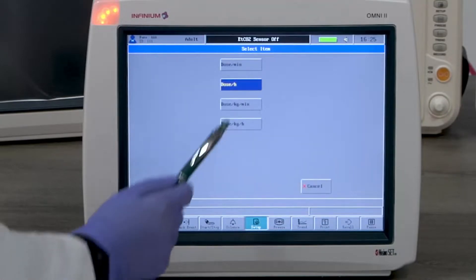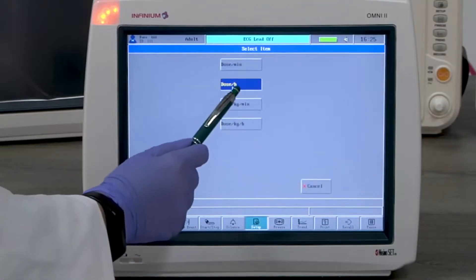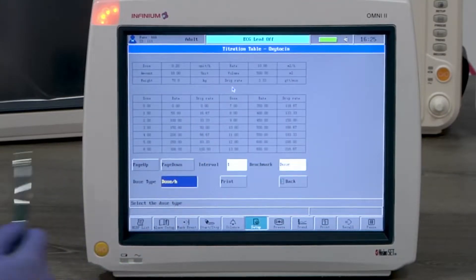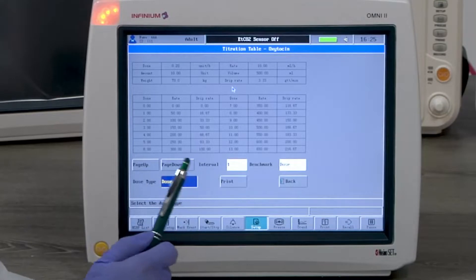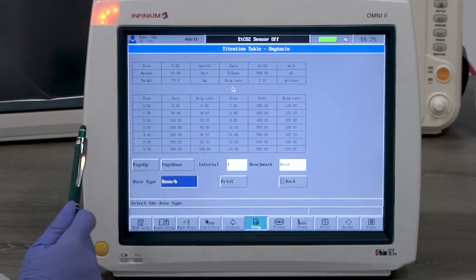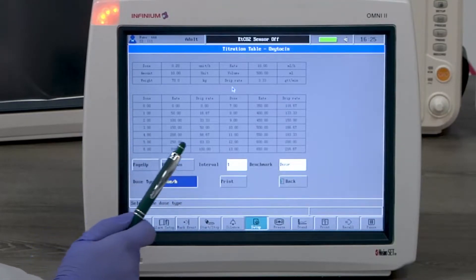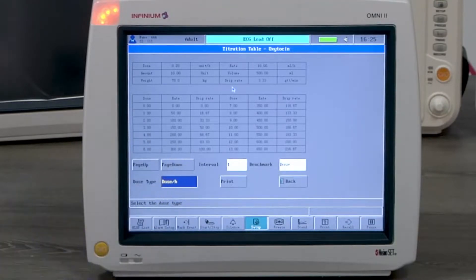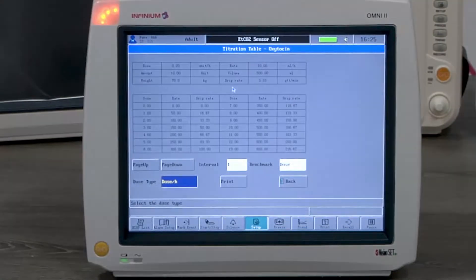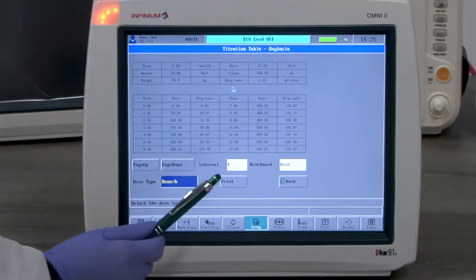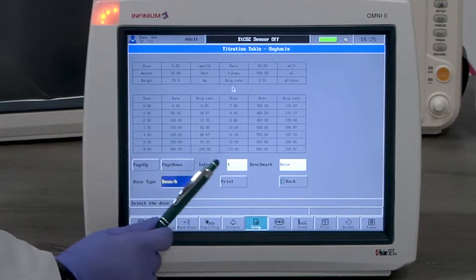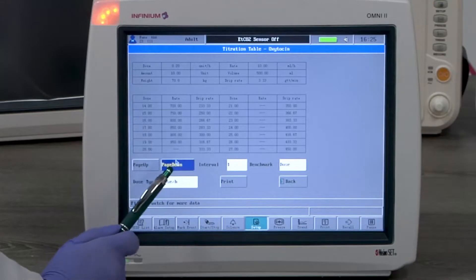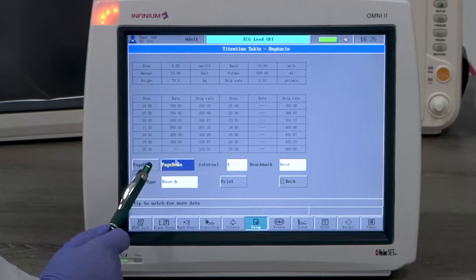Here you can select the benchmark, the interval, and the dose type. We have selected dose type as dose per hour. This chart lists the value of rate and drip rate under different dosages per hour. Select page down to see more results. You can print this table for the record. Here is a sample printout of the first page.